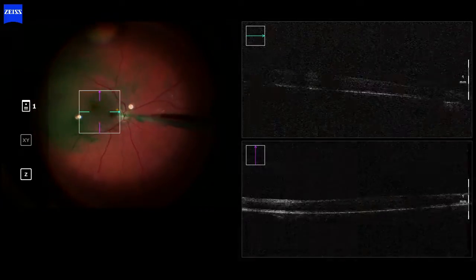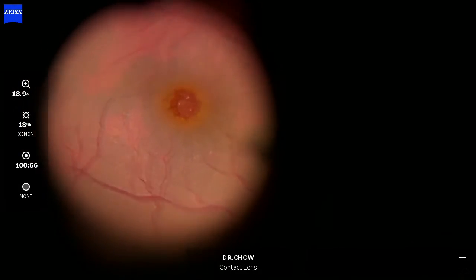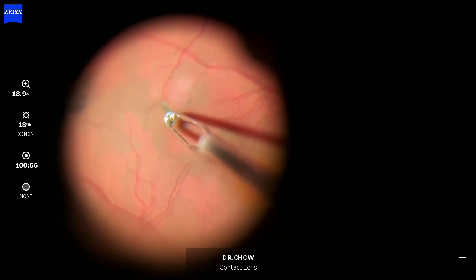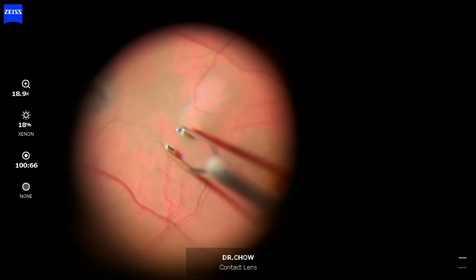With the help of ICG staining to enhance visualization and using a macular flat lens, we proceed to initiate a linear ILM tear that will allow us to create an ILM flap or rug, which the plan is to stay hinged nasally and cover the macular hole.